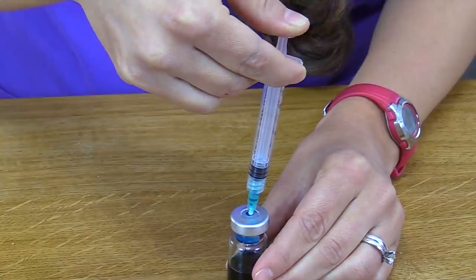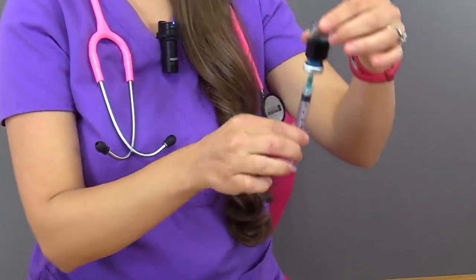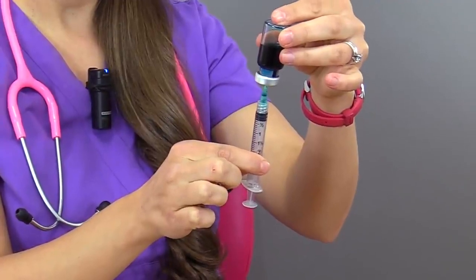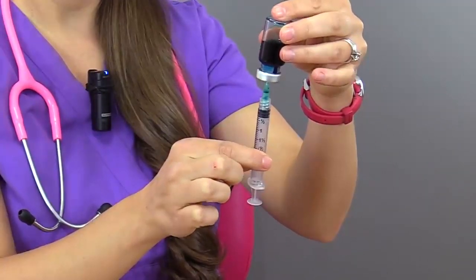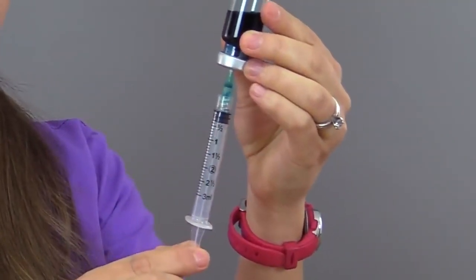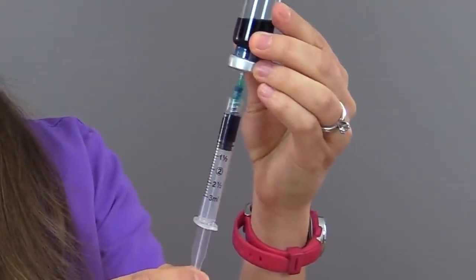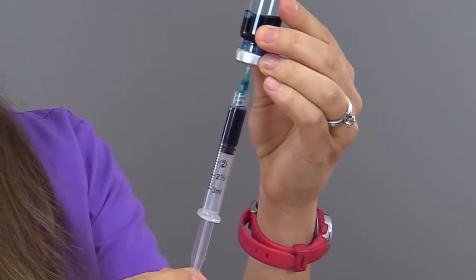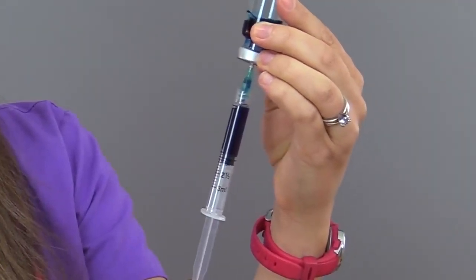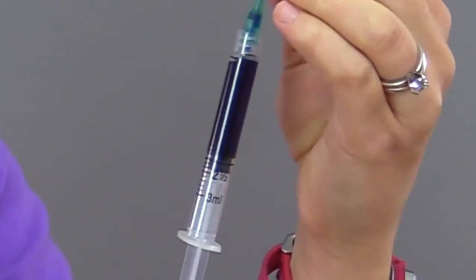Once the air has been injected into the vial, keep the needle access device in the vial. And then invert the vial by using the same hand positions with your non-dominant hand holding the vial and your dominant hand holding the syringe barrel. Once in position, move your fingers down to the plunger flange, and we're going to pull back until we remove 2 milliliters of medication. So we're looking at the barrel markings to the 2, and we're taking care not to touch the shaft of the plunger, just the plunger flange, and we're pulling down to 2, and we're right at 2.